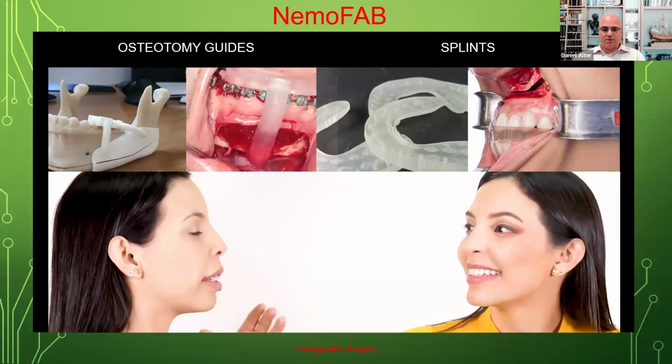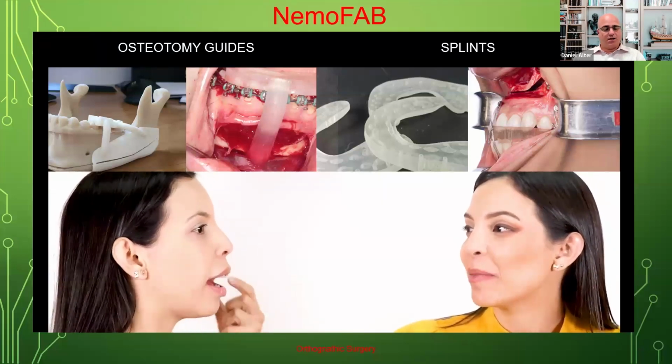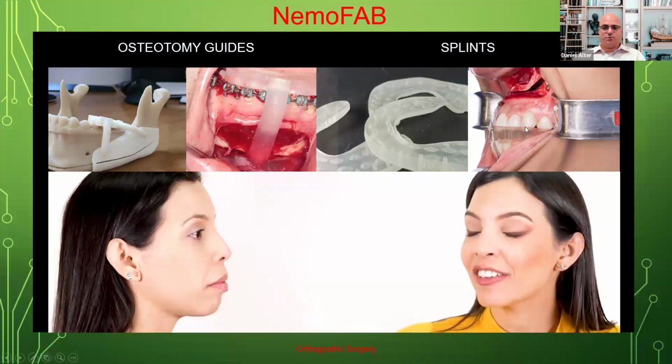In fact, it's the same patient that was helped in many ways by clinicians as well as laboratories in order to create that. They had extensive splints as well as guides, and even ortho, to end up with that kind of result. So it's really powerful. It's what you can do as a laboratory if you so decide. The good news is the tools are here to do it. If that's what you want to do, the opportunity is here and the tools are here, as well as any of the trainings that come along with it.